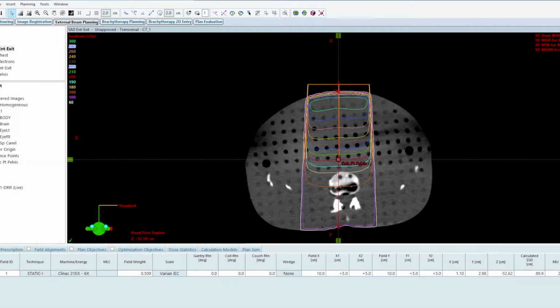In this particular case, if you remember from week 2 with the SSD entrance and exit dose podcast, and I would encourage you to go back and watch it, our isodose lines look fairly similar. I have a max dose point again at 316. Before I was at 309. My 100 centigray line travels all the way through the patient's body. This is instead of a 100 centimeter SSD, you can see my SSD is roughly 90 centimeters.